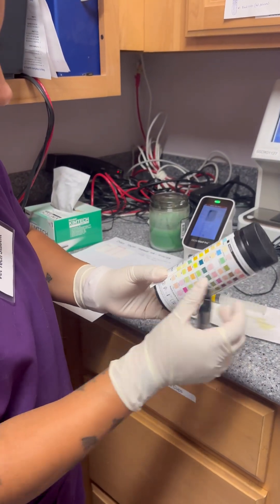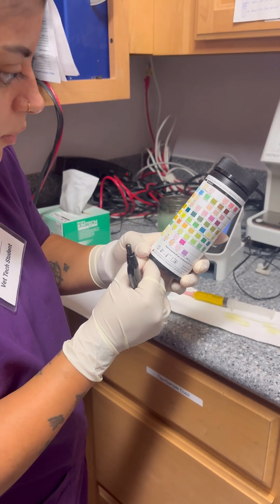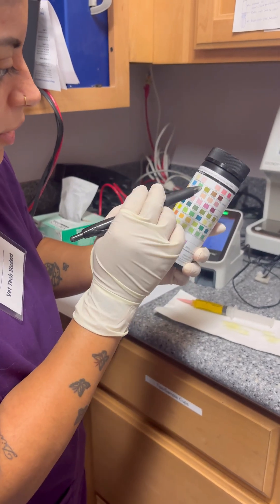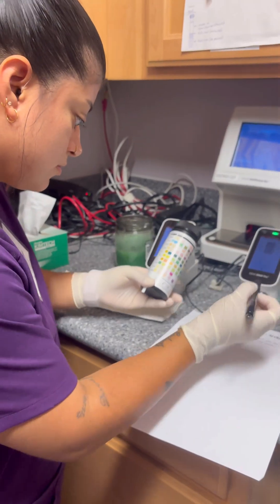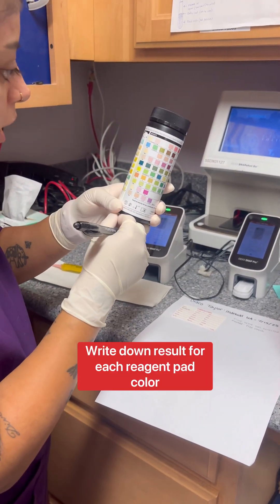I'm using this to line it up. Urobilinogen is negative. Glucose, negative.